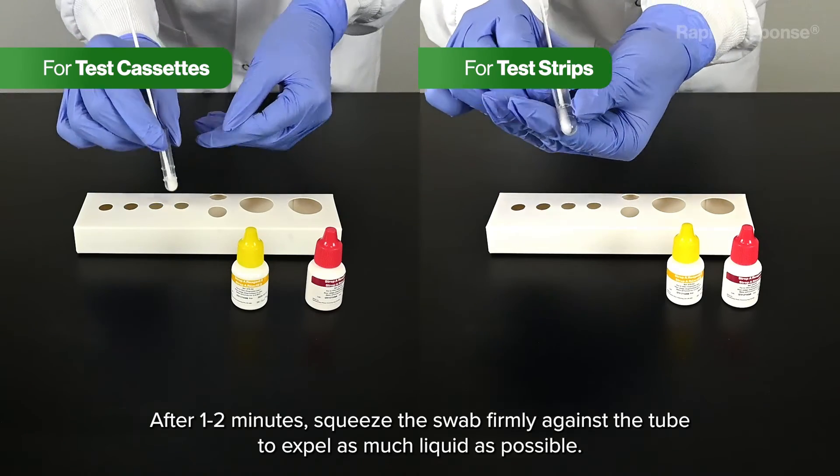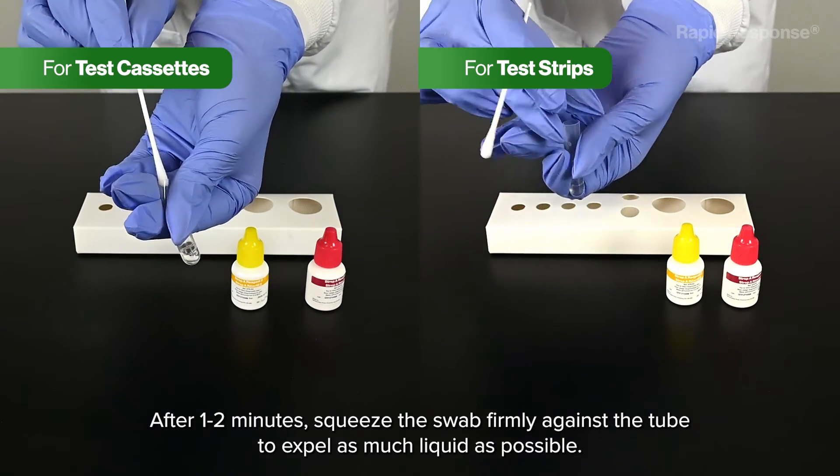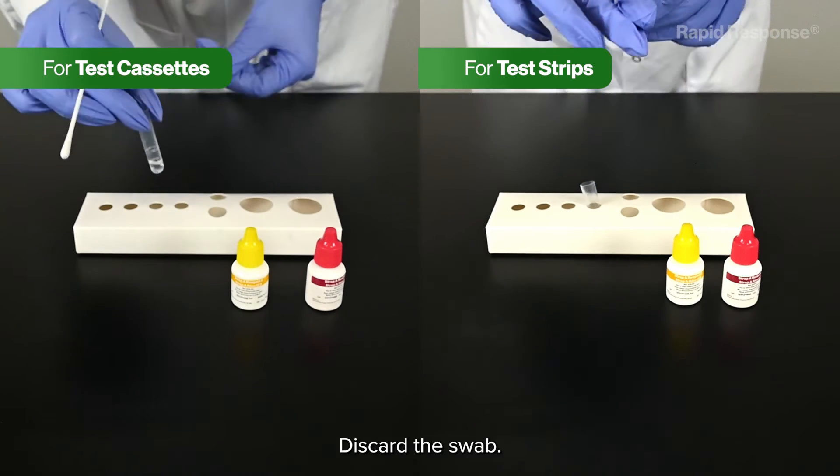Let stand for one to two minutes at room temperature. After one to two minutes, squeeze the swab firmly against the tube to expel as much liquid as possible. Discard the swab.